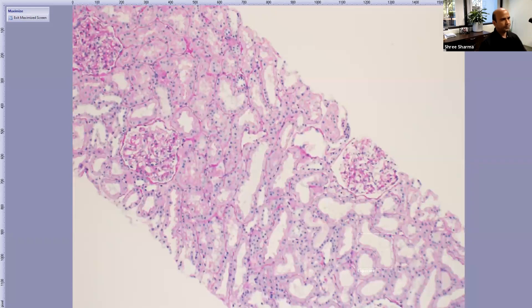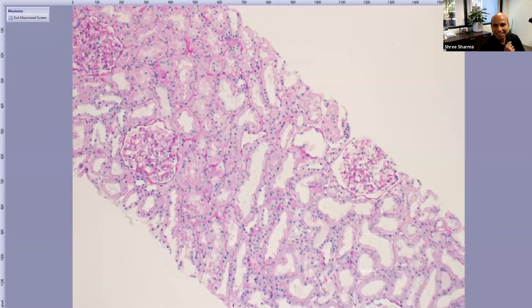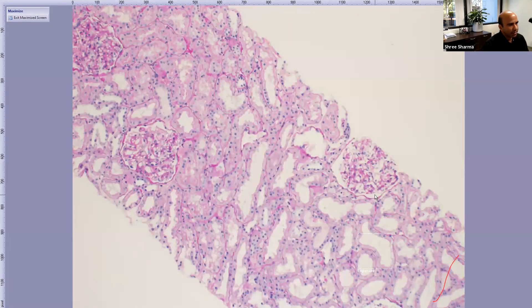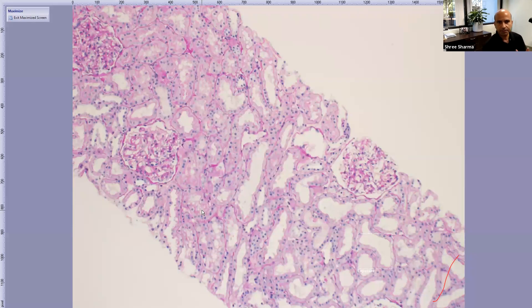Starting with a normal kidney biopsy: the glomerulus is normal with no proliferation, and the tubules are normal — back to back with nothing within them. If you see a normal kidney biopsy image, what might be the clinical presentation? Why might this biopsy have been performed? What are the indications?